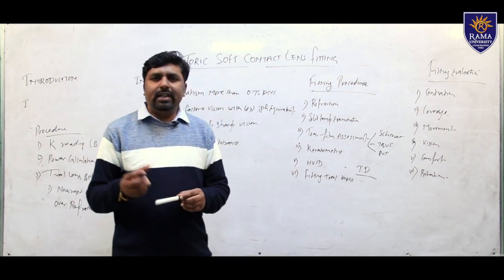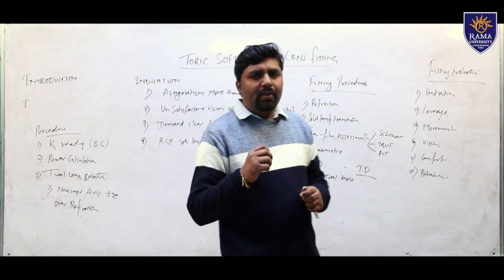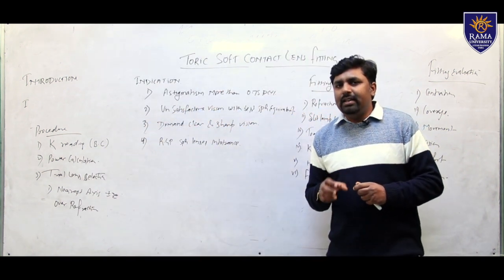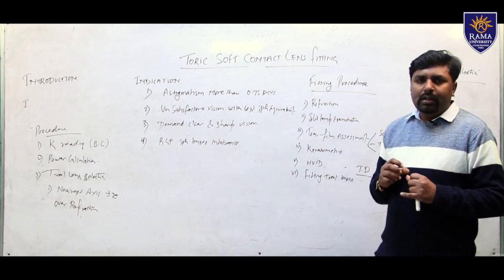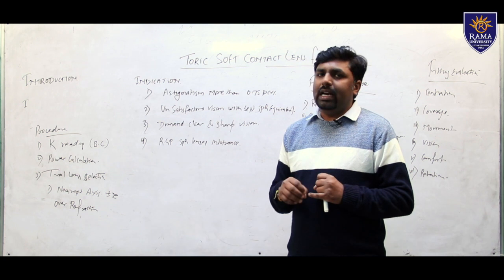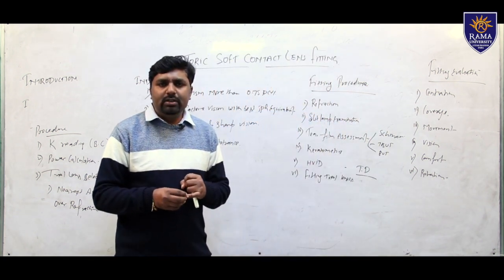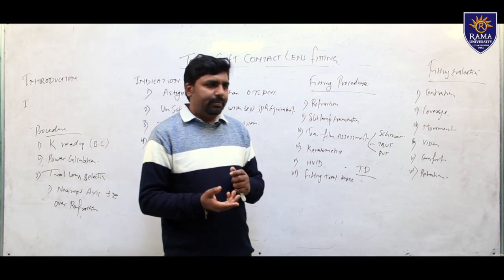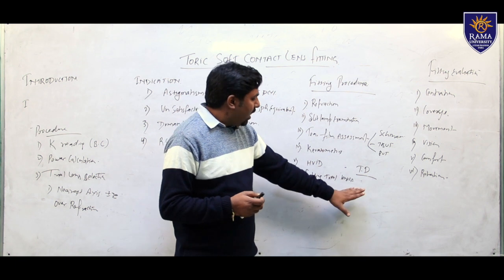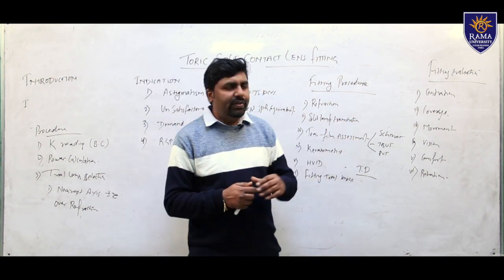Next, we have to select the trial lenses. Trial lenses are the lenses that, before prescribing any lenses to the patient, we always go ahead with first for trial purposes. If the trial lens fitting is good, movement is good, and vision is good, we can go ahead with the final prescription. So after this examination, we have to go for the fitting evaluation.